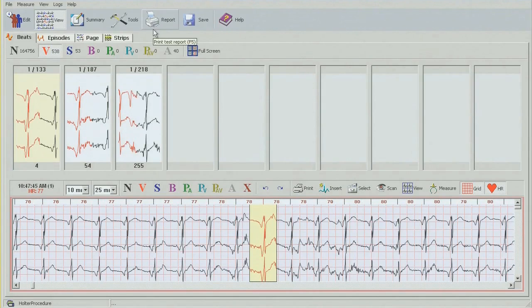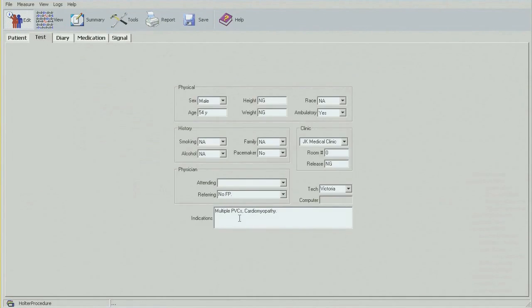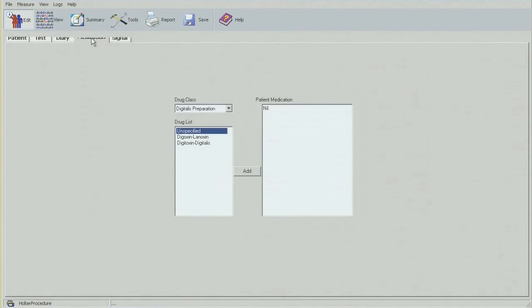I'll be working from left to right, starting with the Edit section. This is where we can input all the demographics: patient name, date of birth, reason for test, referring physician, patient diary, symptoms if there are any listed, patient medication, and so on and so forth.